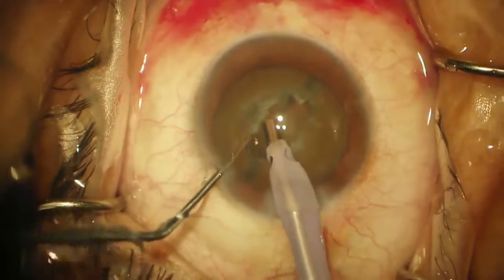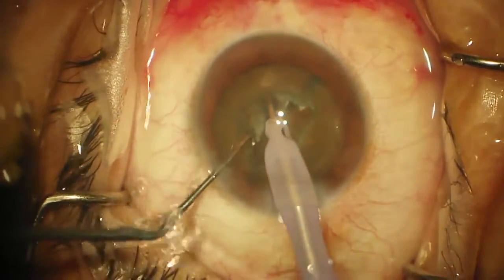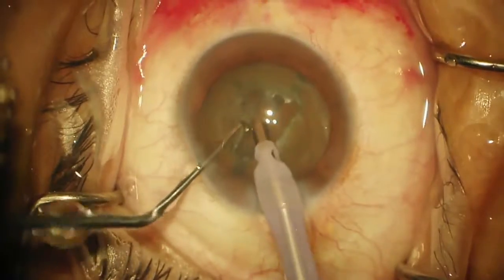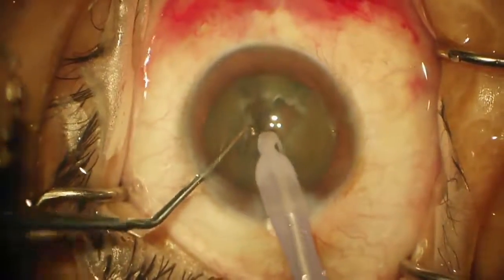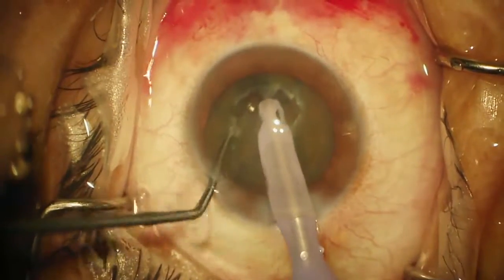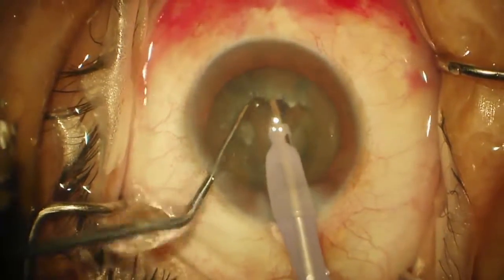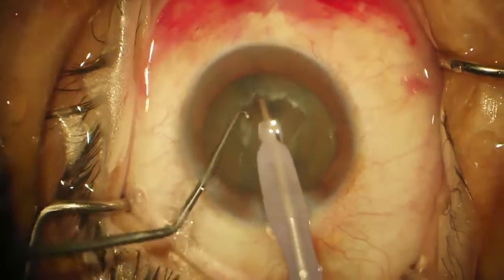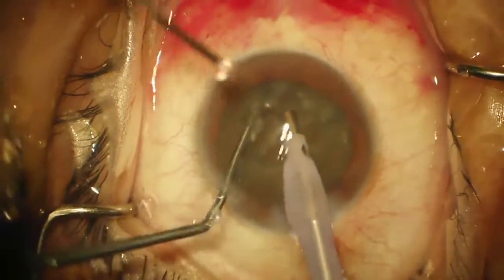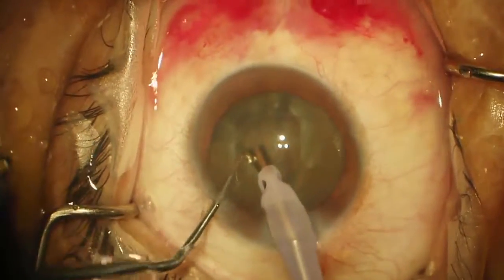I'm going to create a little pie shape because we'll do this mostly as a chop — this is a modification of the stop and chop. I know exactly how deep to go because I know how deep I made my original trough. You go to the base and pull apart and crack. Now I've got this little quadrant right over here, and I can go right in behind it and kind of force it and pull it into the front of the eye.